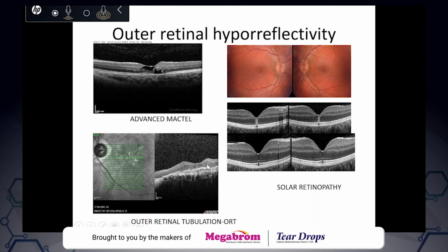What you see as round here is actually the photoreceptors arranged here. And these are not cysts. You should not give an intravitreal injection thinking that they're cysts. Actually, this is evidence that the disease cannot be cured, and you need not inject. These are actually not cysts. The photoreceptors are arranged in a circular fashion.